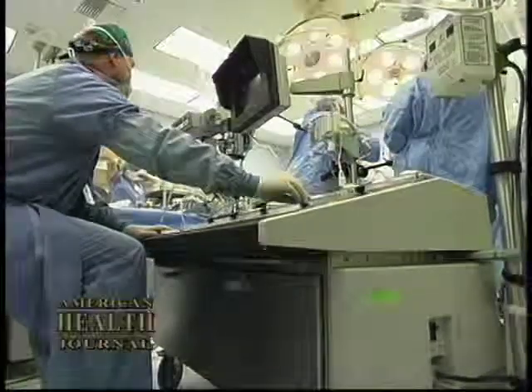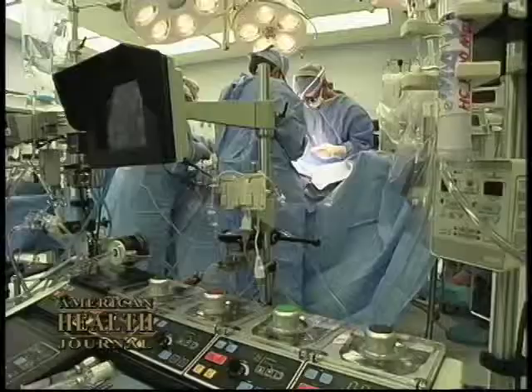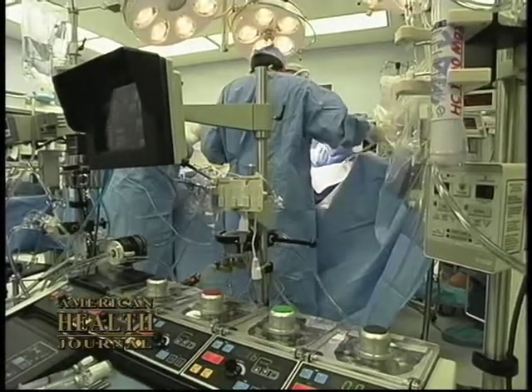The off-pump surgery implies that you don't use that, so you use a technique in which you bypass the heart while the heart is beating. It's more technically demanding, it's more challenging, and the results are very good.